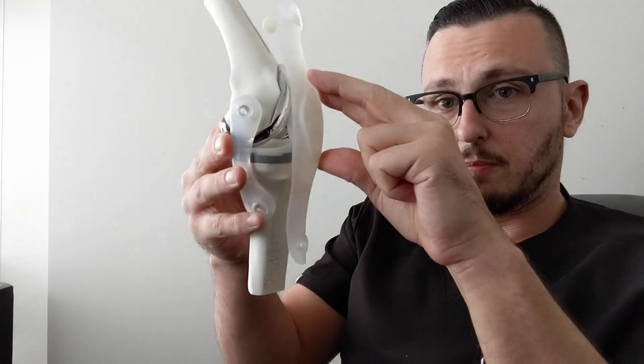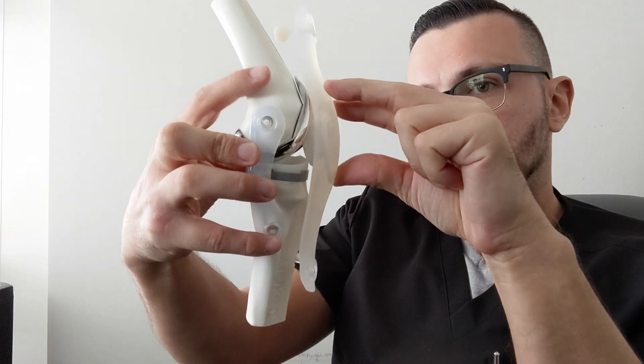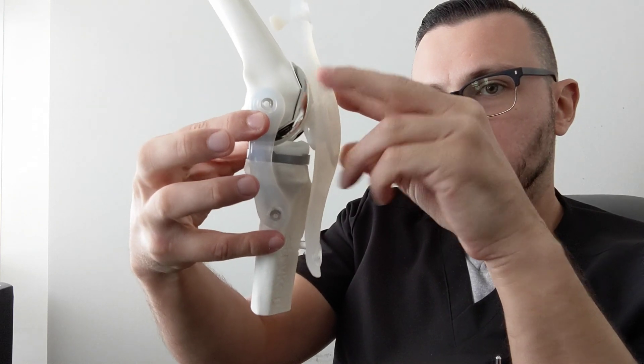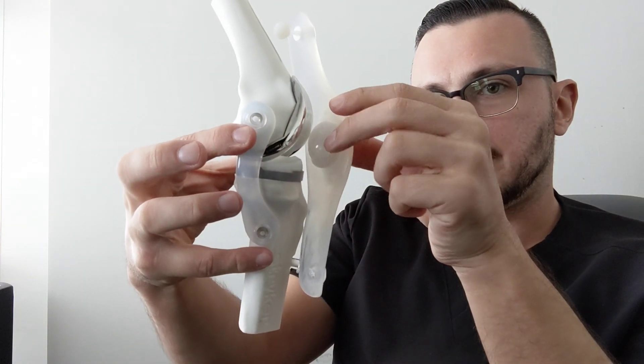A knee replacement is, I have a model here, but here's a model of the knee with the knee replacement in place. So this is the femur or your thigh bone. This is your tibia, which is your leg bone. And then this is your kneecap in the front of the knee.